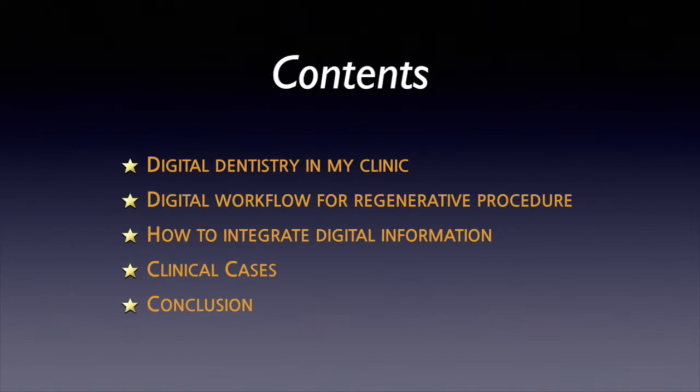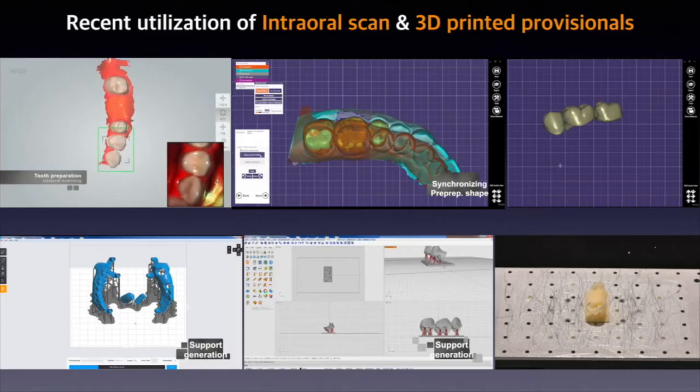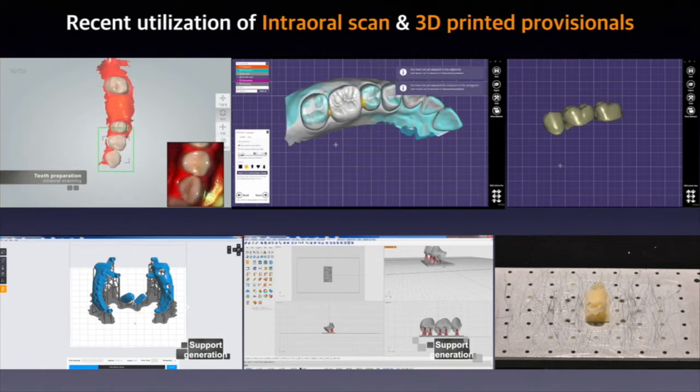The order of this presentation would be like this. Before we get into my main topic, I'd like to show you how I utilize digital devices for restorative dentistry first, as most of you do in your clinic on a daily basis, so do I. Scanning, 3D printing for provisionals.